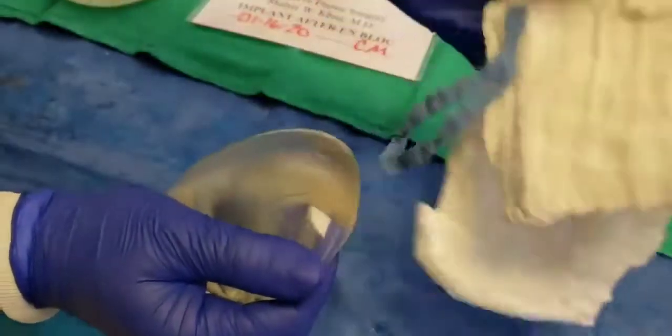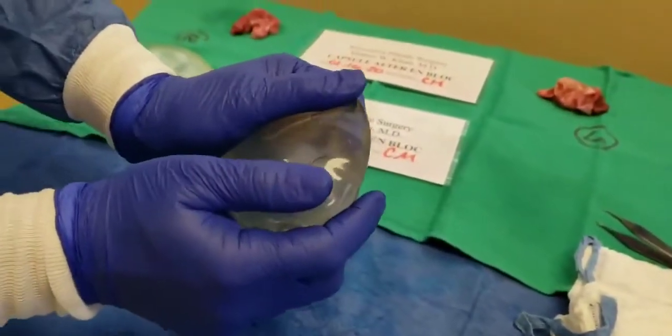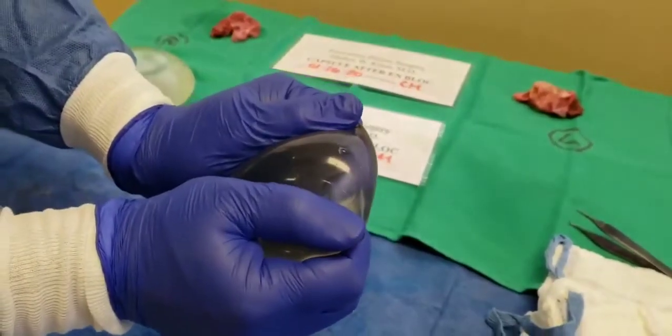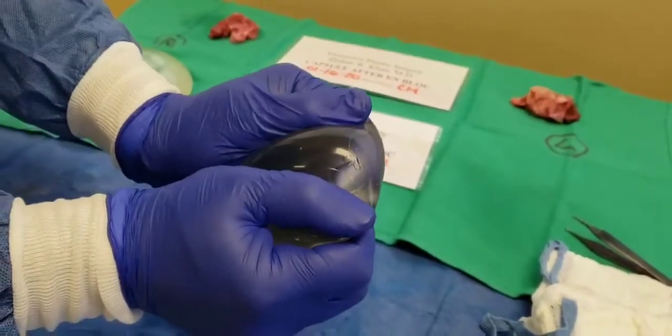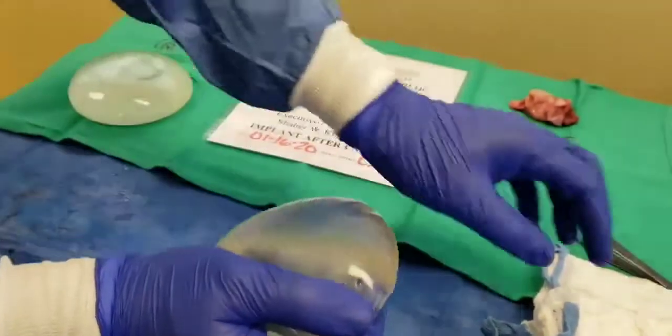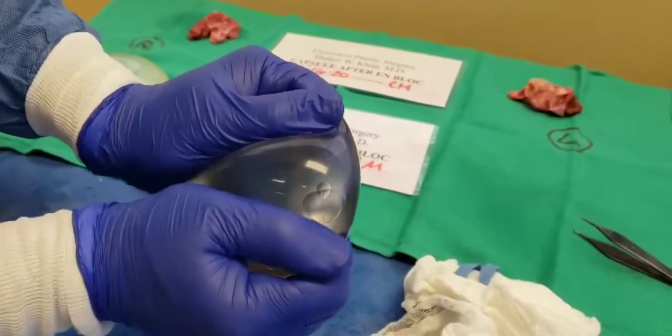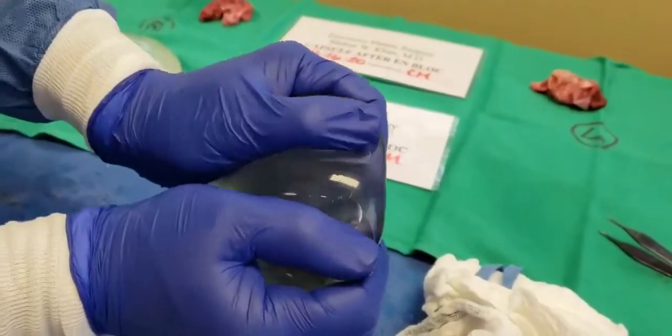And look, this is more fluid that's pouring out rather than consistent with what I would call the cohesiveness of a silicone implant. So as you can see right here, this is more fluid coming out rather than the silicone. And again, as you will see, this is going to literally pour out like water, and this is where that break and the bubbles are present.